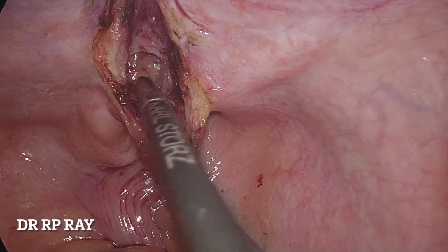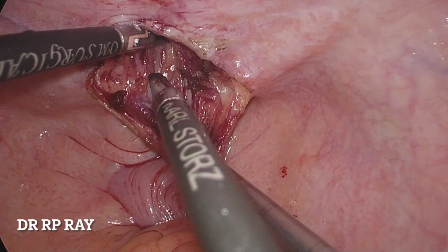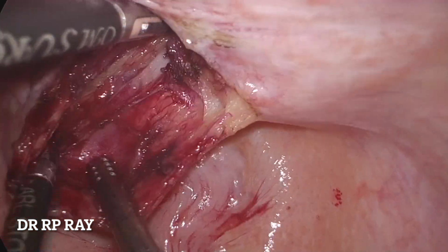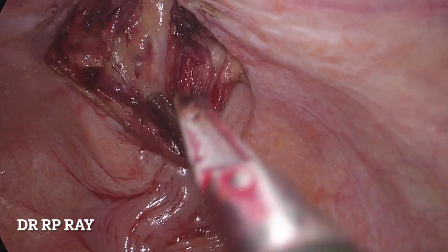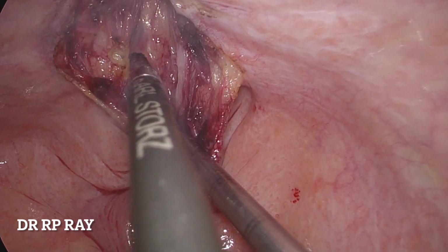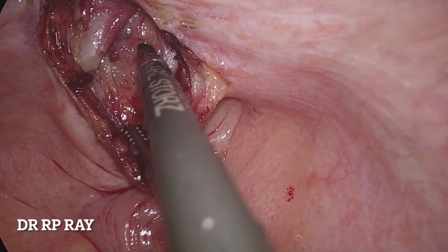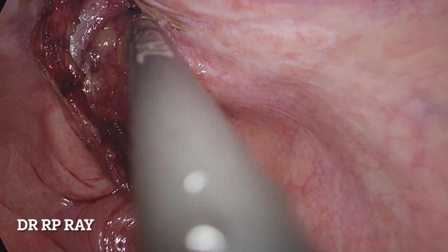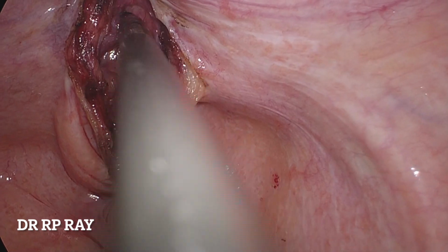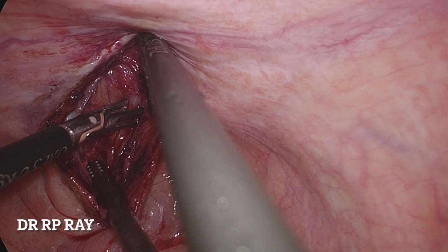In the midline, the dissection is continued and a plane is developed in between the prostate and the rectum as much as possible. Sometimes you can go up to the apex of the prostate. The seminal vesicle and the vas deferens will appear as a glistening white structure. This is the tubular, possibly a vas deferens, and then try to continue the dissection and free this vas deferens and the seminal vesicle from the surrounding fascial attachment.